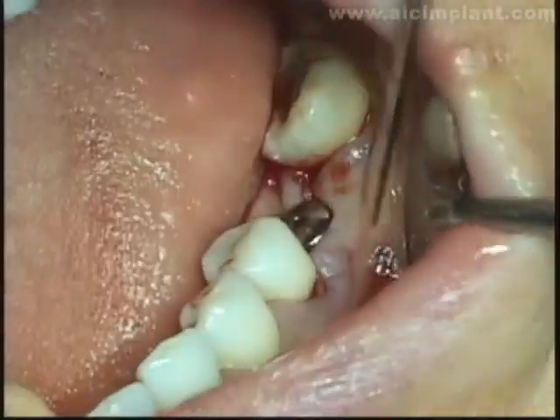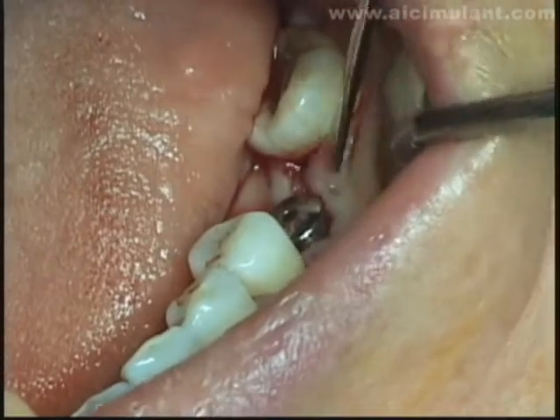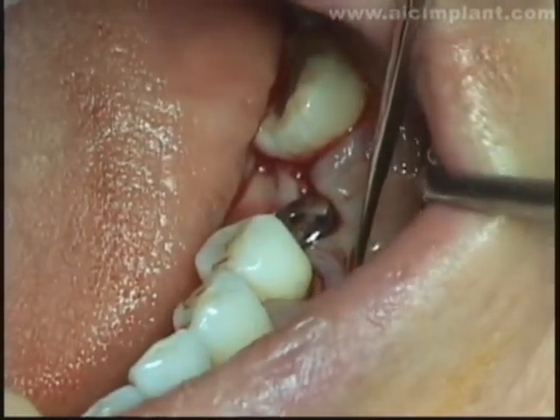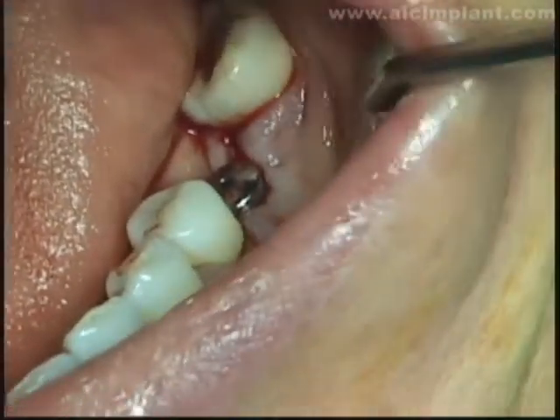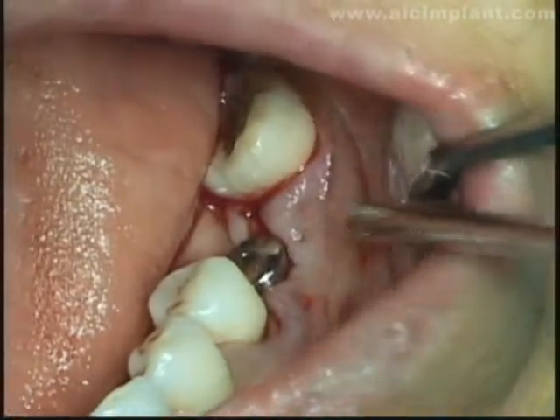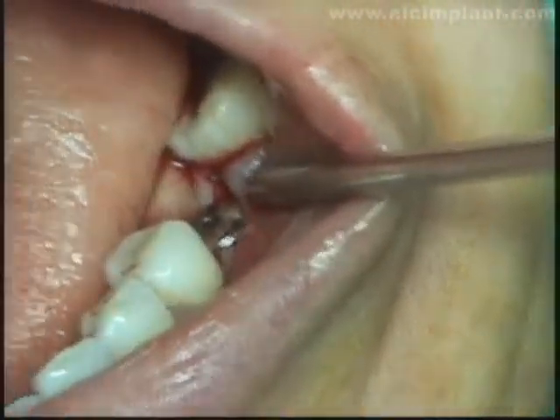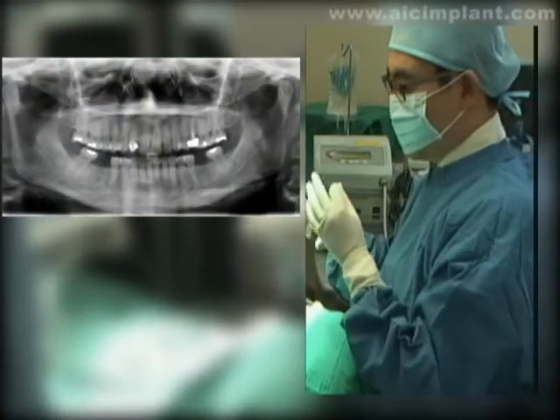Note that the gingival and healing abutment levels are almost equal, and this height is appropriate. If a healing abutment about 2 millimeters to 3 millimeters taller than the gingival height is used, a situation similar to the one I mentioned earlier may occur. Thus, I prefer using a healing abutment that is not too tall.